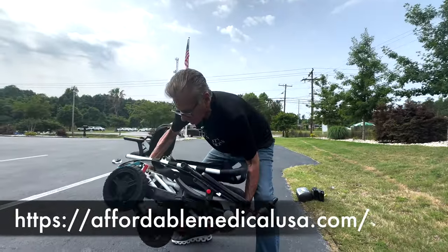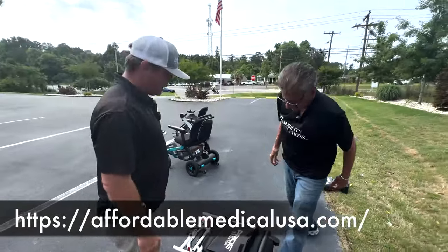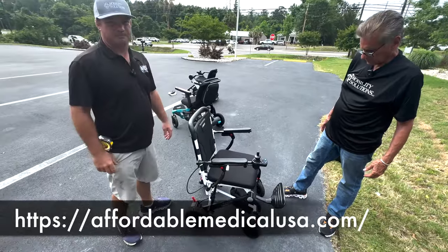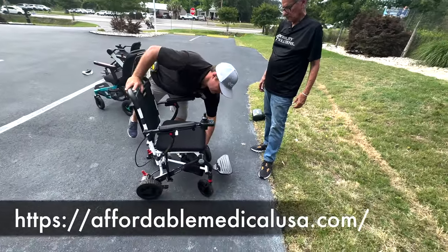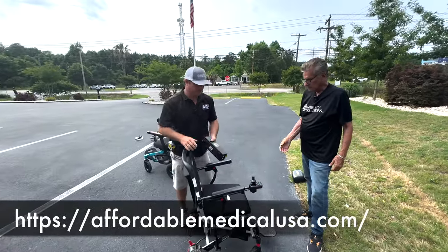Yeah. Lighter? Yeah, much lighter. We know that. We know this is a light chair. To unfold it, grab it here, and kind of bring it back. Was the battery in on that? Battery was even in on that. So you can reduce that weight by taking this out. It's like 4 pounds.